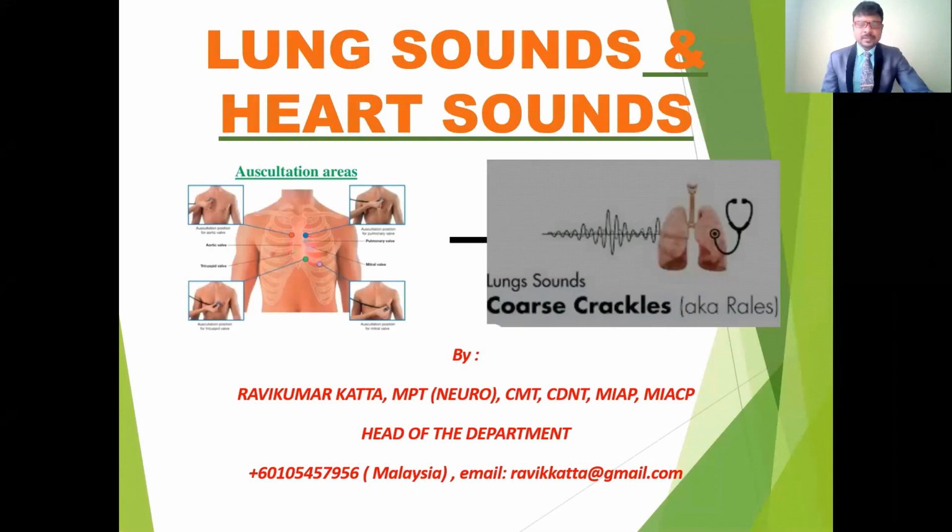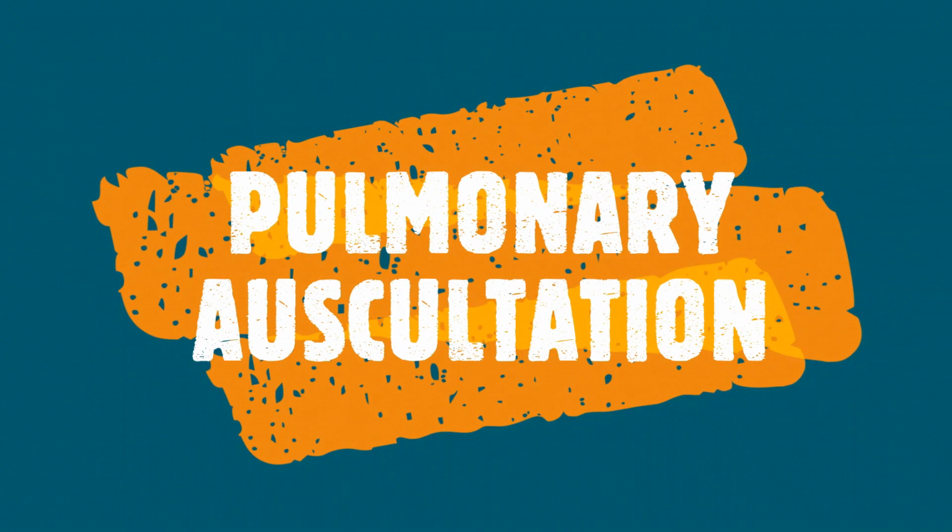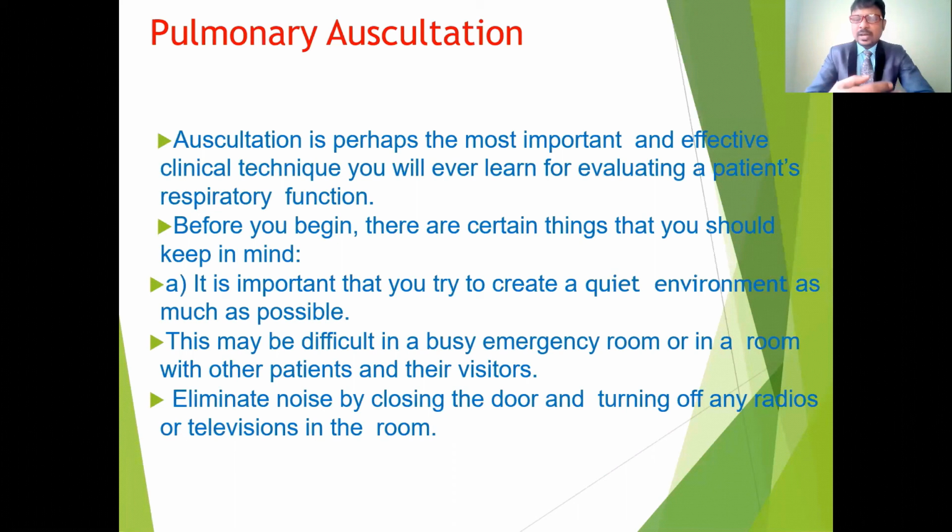Hello everyone. Today I'm going to discuss the lung sounds and heart sounds in the diagnostic clinical examination. First, coming to pulmonary auscultation, we are going to check for the lung sounds.